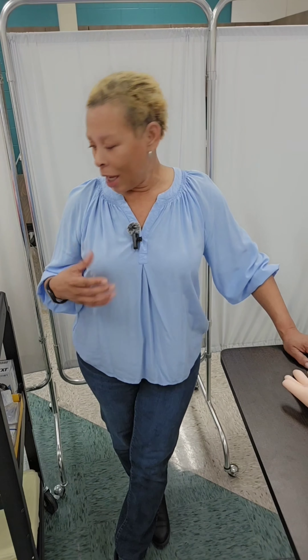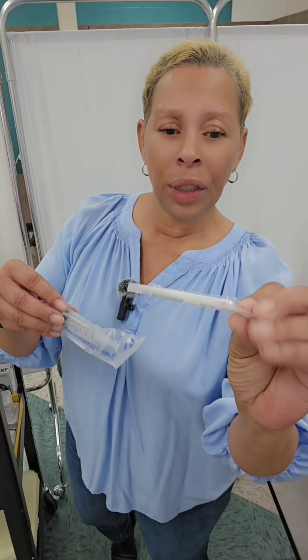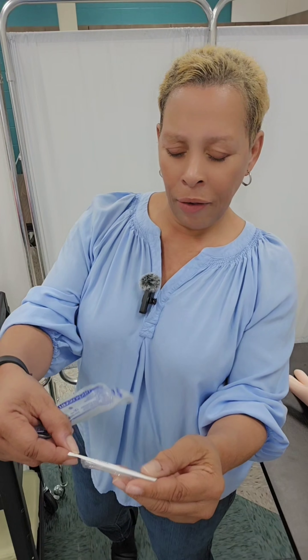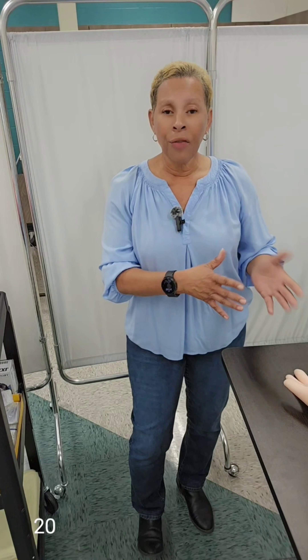You can either use a vacutainer or you can use a straight multi-purpose needle with a syringe — such as a 20 gauge straight needle with a five milliliter syringe. You can use that as well as the vacutainer to draw blood, whichever way you feel comfortable with or whichever method your patient prefers.